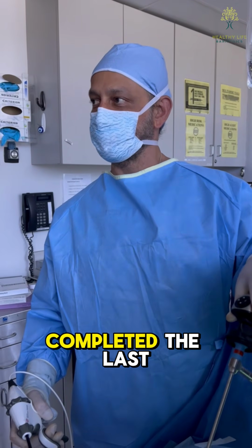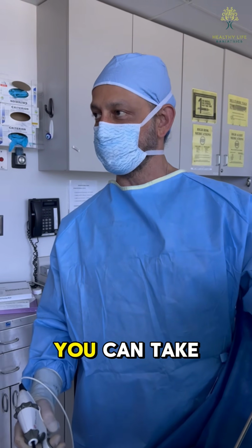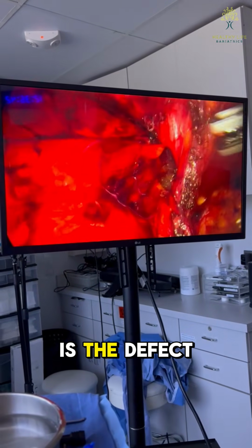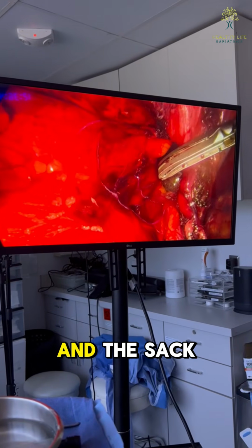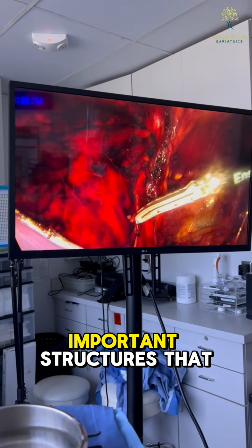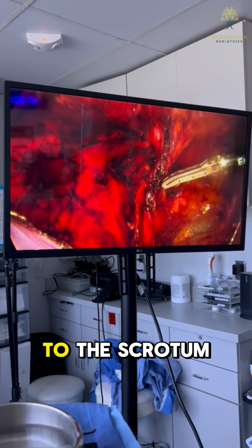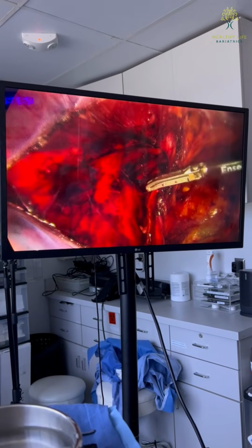Now we have completed the last portion of the operation, which is that we have dissected all the structures. You can take a look over here and you can see that this is the defect, a large defect where the bowel and the sac were penetrating this area and going towards the scrotum down that way. And these are important structures that provide blood supply to the scrotum and testicles.